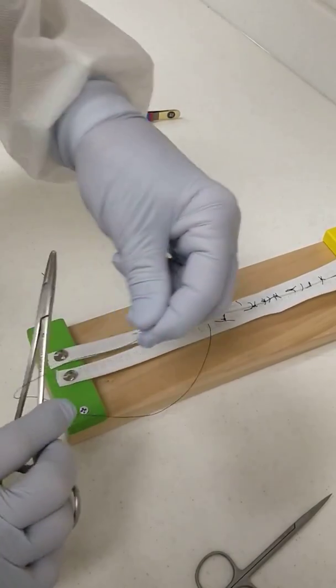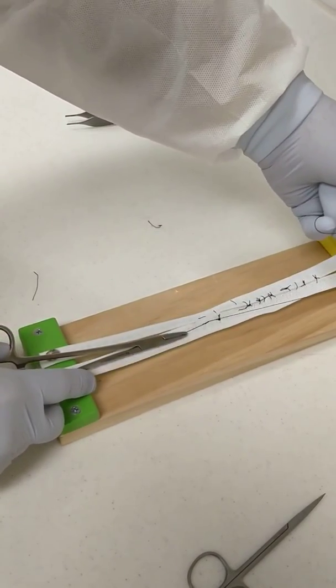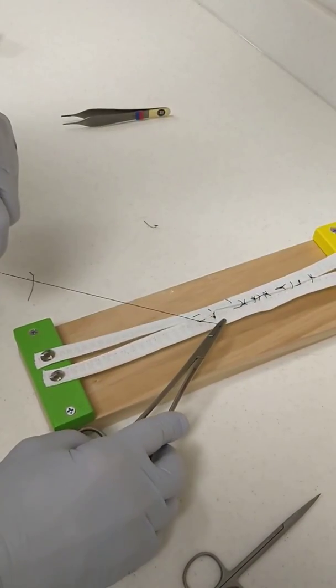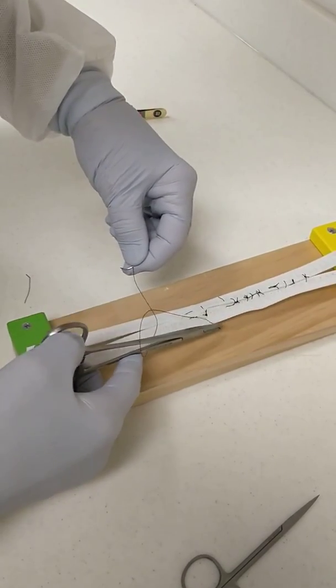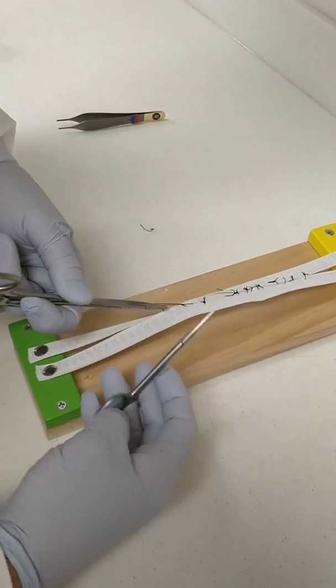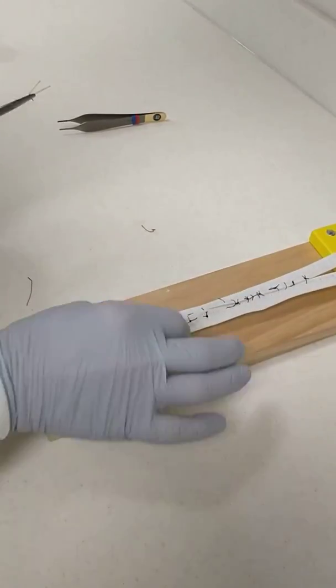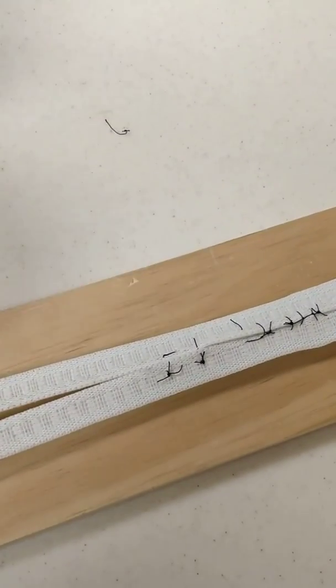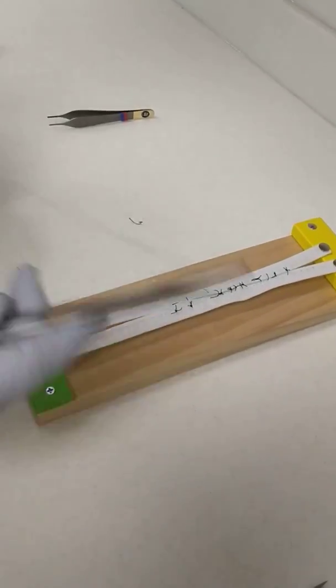Now you just pull this tight on the buckle. That's the horizontal mattress. And it's useful when you're trying to bunch the tissue together, especially when it's trying to pull apart.